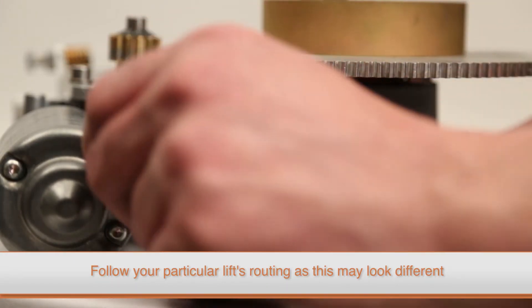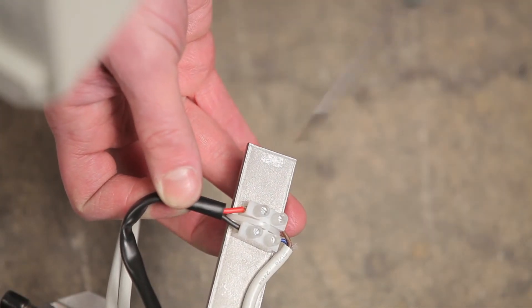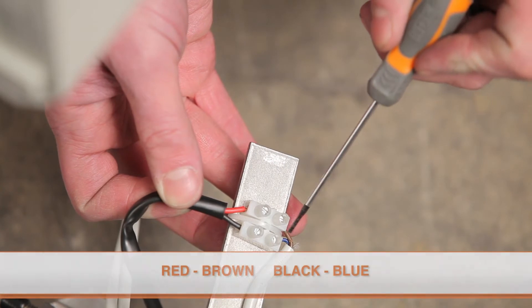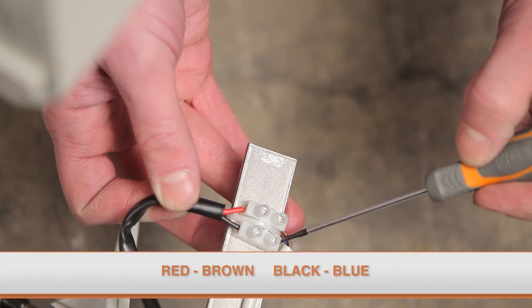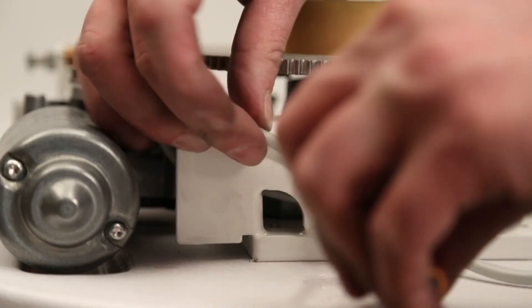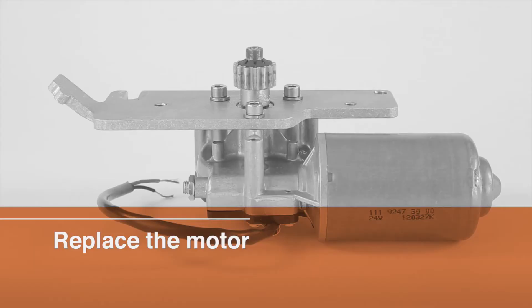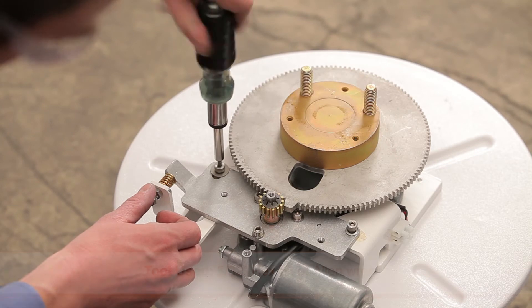Thread the cable through the lift cover and then follow the original cable routing. Connect the end of the cable to the terminal block, making sure that the red wire from the motor is matched to the brown wire from the cable, and the black wire from the motor is matched to the blue wire from the cable.